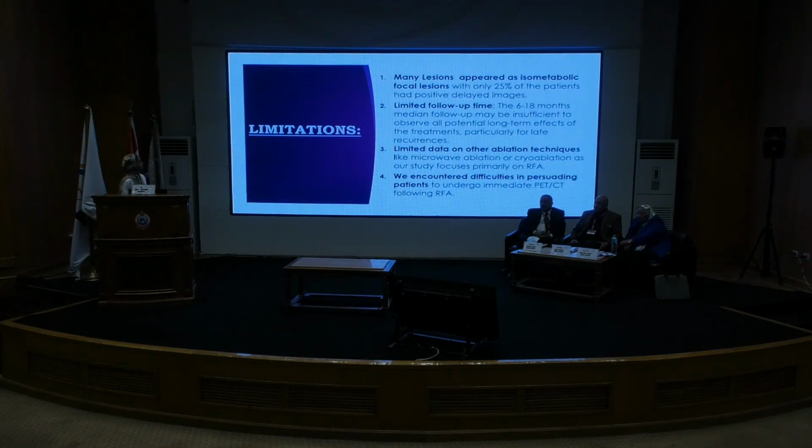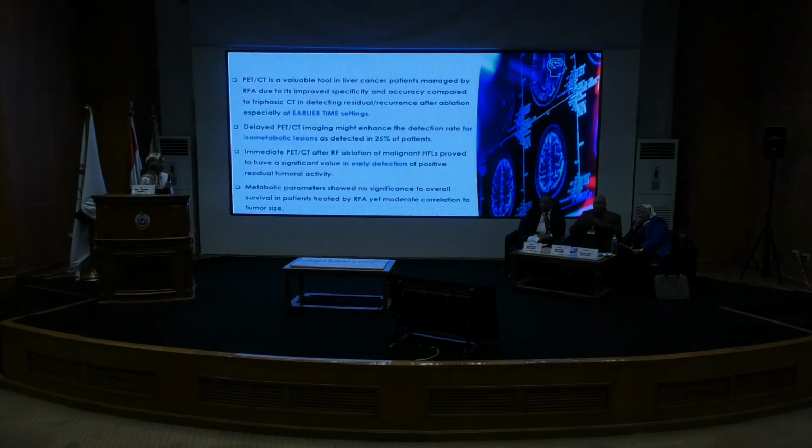Regarding the limitations, many lesions, and by many I mean many, appeared as isometabolic focal lesions, with only 25% of the patients having positive delayed images. Limited follow-up time: the 6 to 18 month median follow-up may be insufficient to observe all potential long-term effects of the treatments, particularly late recurrences. Limited data on other ablation techniques like microwave ablation or cryoablation, as our study focuses primarily on RFA. We definitely encountered difficulties in persuading patients to undergo immediate PET-CT following RFA.